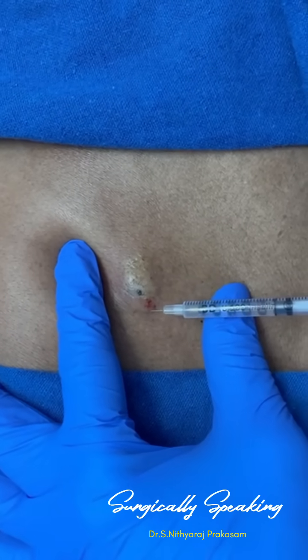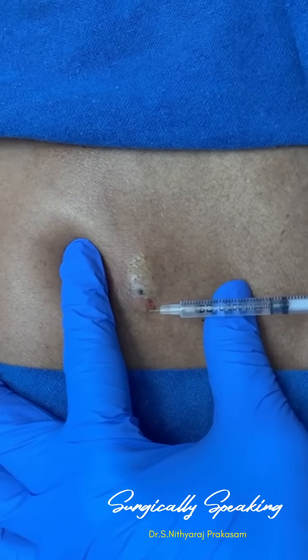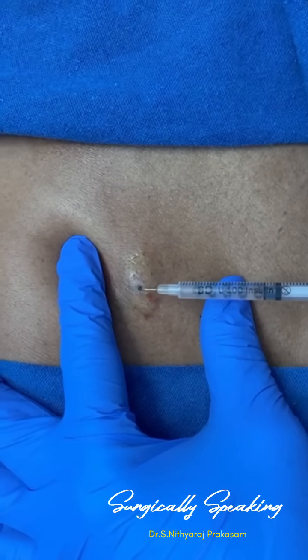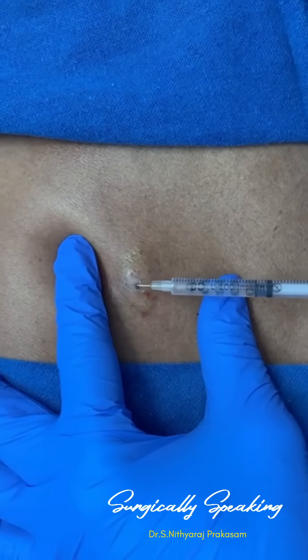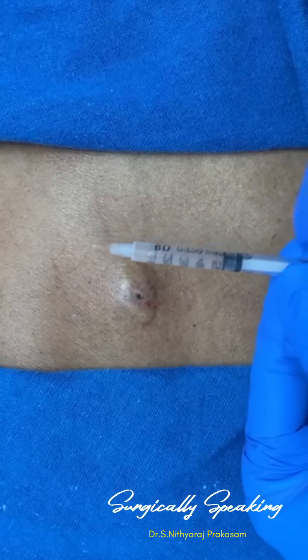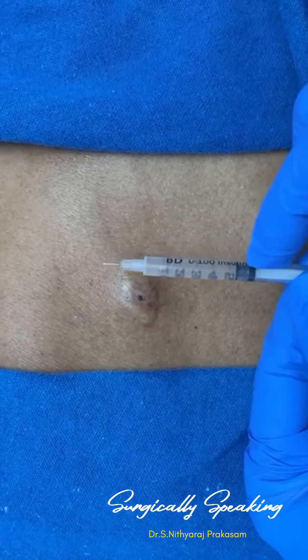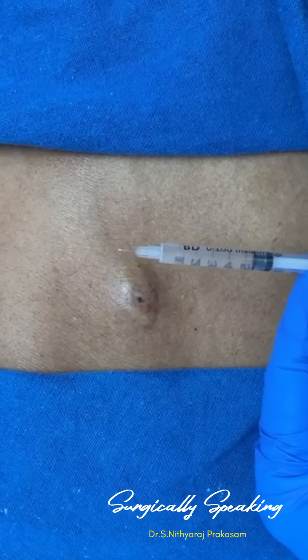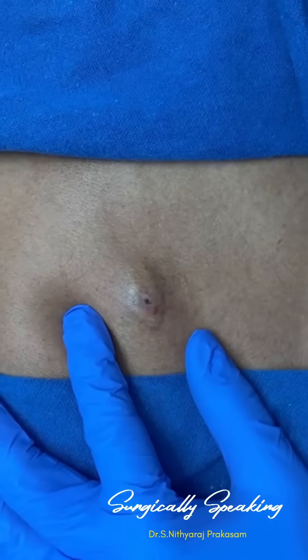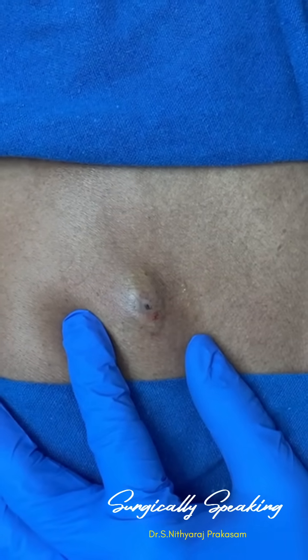As I infiltrate intradermally, a wheal is being raised, and this punctum is becoming more prominent. Look at the quantity I have used, less than half a cc. And now immediately there is a tumescent effect.